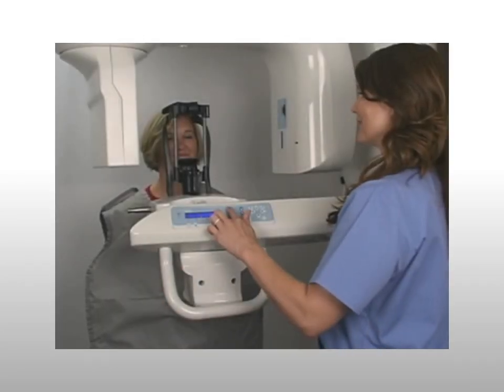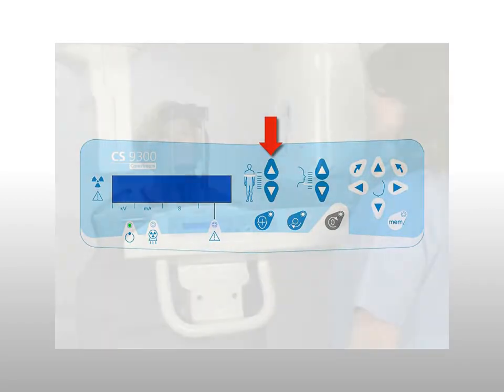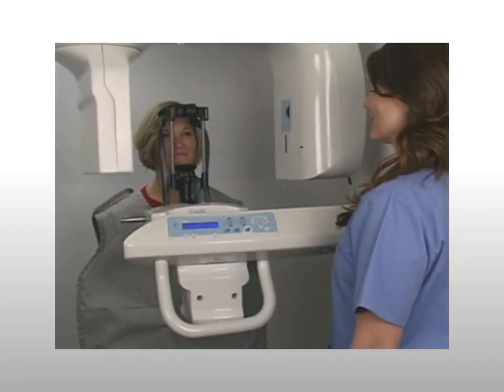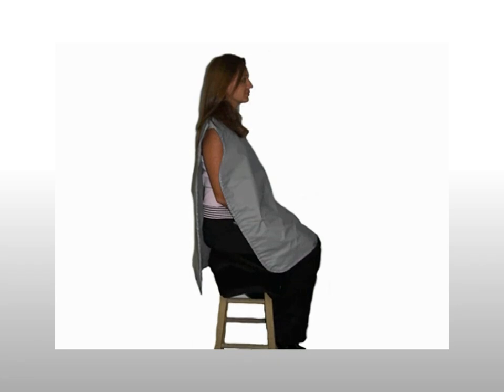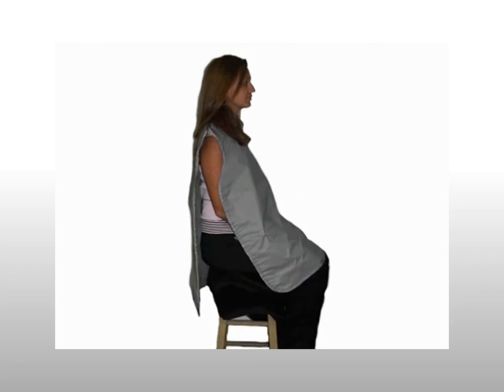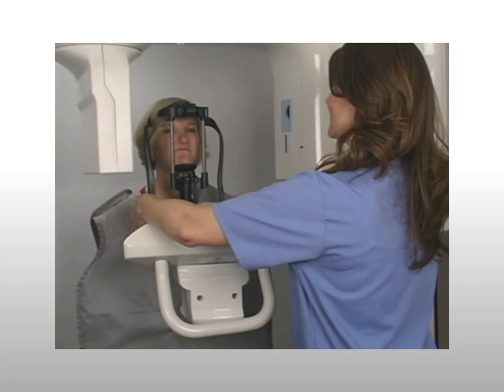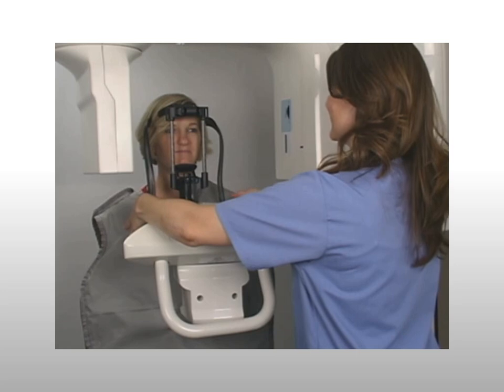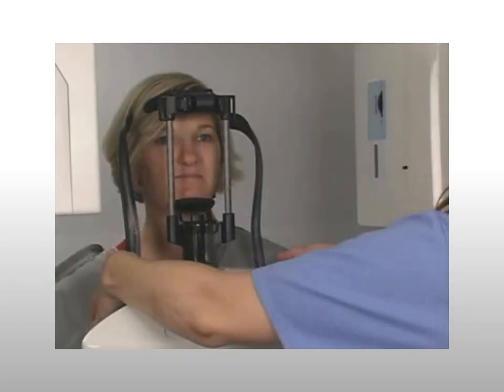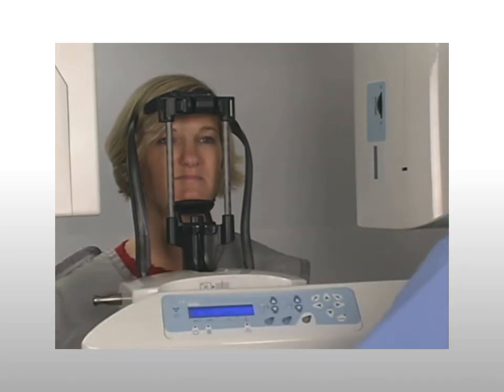To adjust the machine to the patient's height, use the height adjustment button to move the machine up or down to enable the patient to comfortably place the chin and forehead into the head support. If the patient is tall, have the patient sit on a stool and adjust the machine accordingly. After the machine is at the correct height, open the temple supports and instruct the patient to step forward and place chin and forehead into the head support.